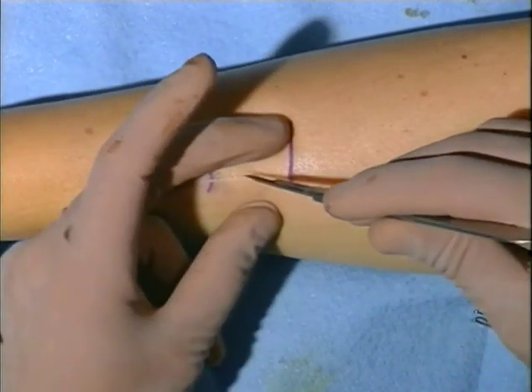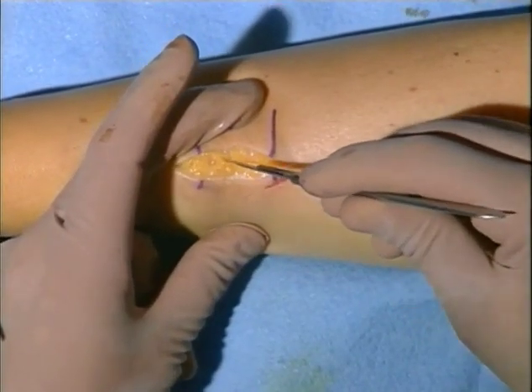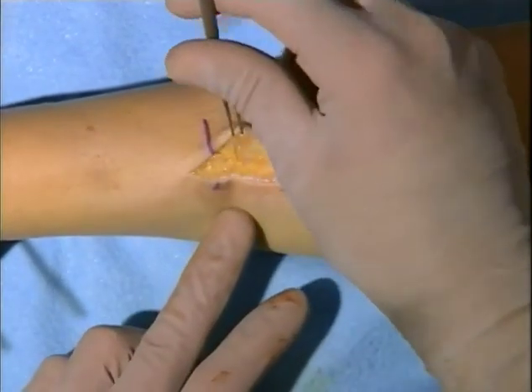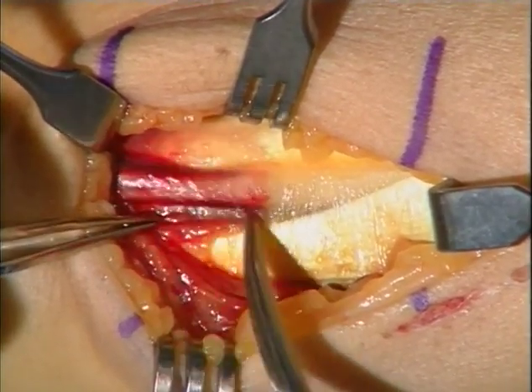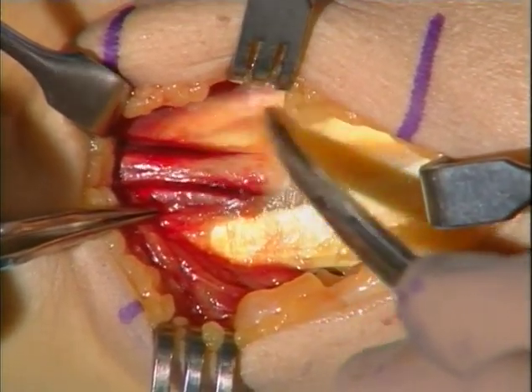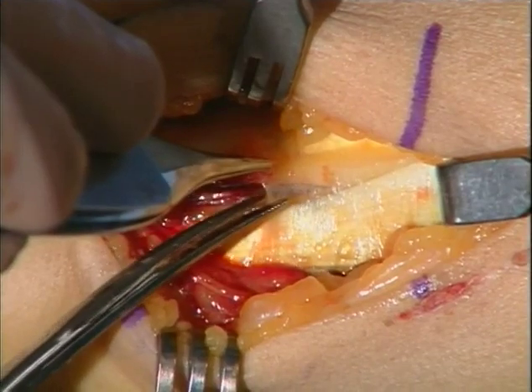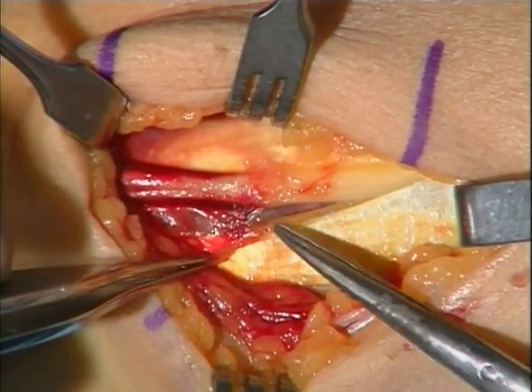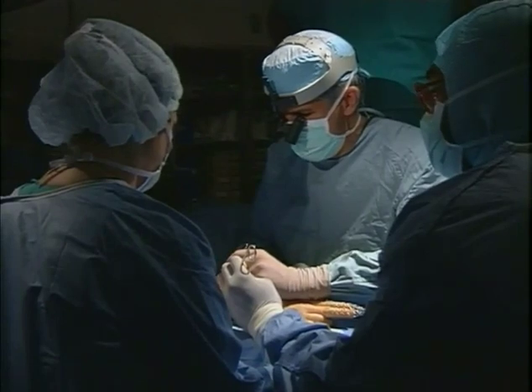We favor a longitudinal incision that's a little bit bigger than you think you might need. The most important thing, of course, is to make an open incision to purposely identify and retract the radial nerve, and also to avoid nailing the mobile structures — the radial wrist extensor tendons in particular — to the skeleton. In the depths of this wound, you can typically see the forearm fascia with the hemorrhage around the radial nerve as it escapes from the forearm fascia between the brachioradialis on the palmar side and the extensor carpi radialis longus and brevis on the dorsal side. If the radial nerve is damaged during dissection or pin insertion, you have a major problem with pain as well as loss of sensation on the dorsal radial side of the hand.